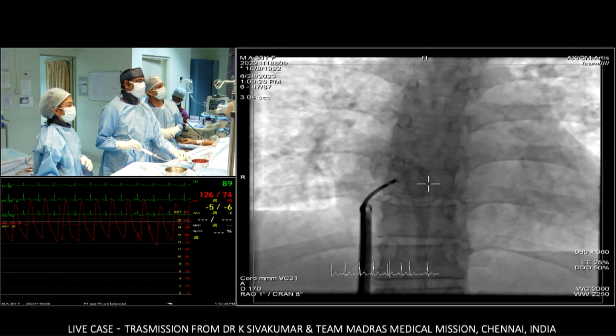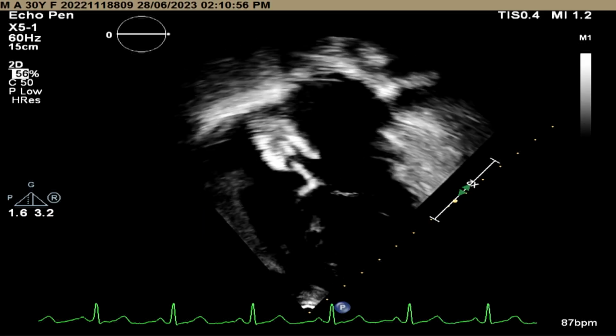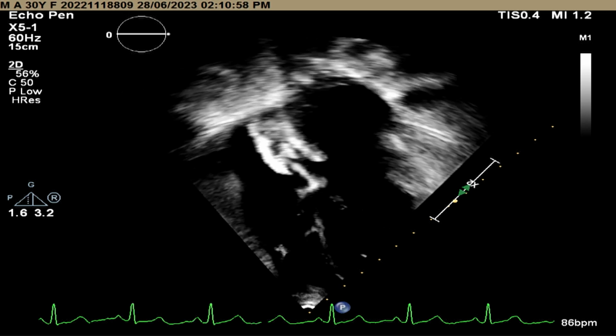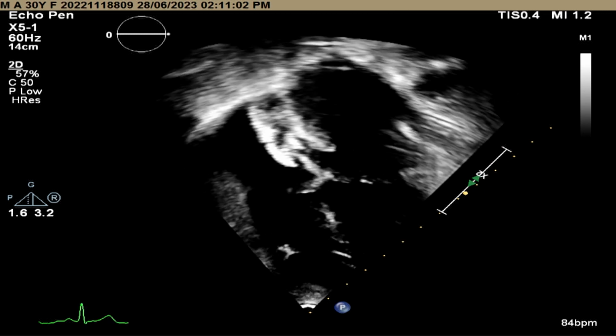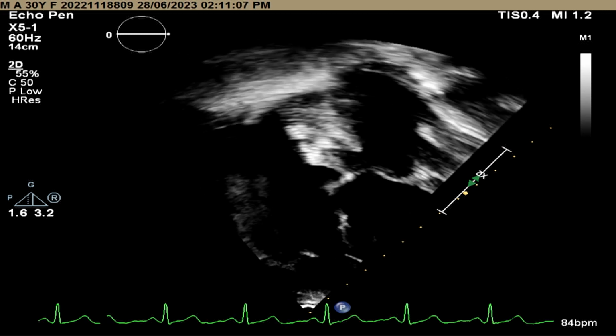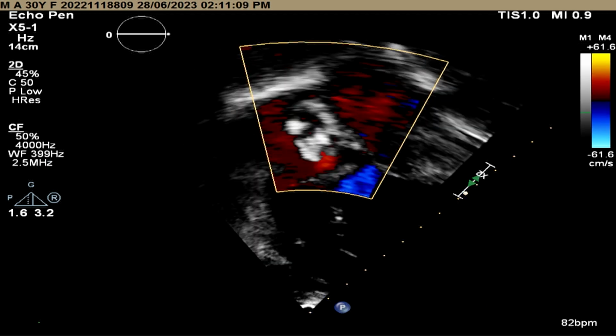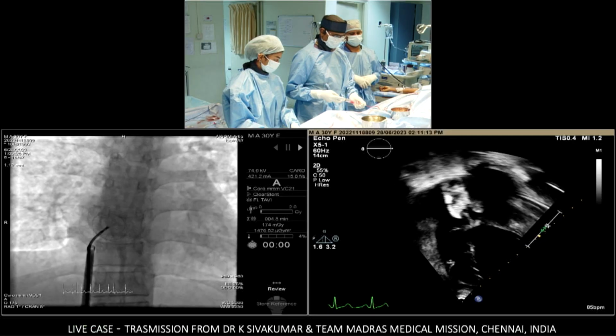Show the echo big. Is Mai virtually attending this meeting or is she physically present? No, she's here, but the microphone's not functioning. Okay, in the meantime, Raphael, I think. Hello? Now it's functioning. Yes, can you hear me now? Yeah, Mai, I'm able to hear you.